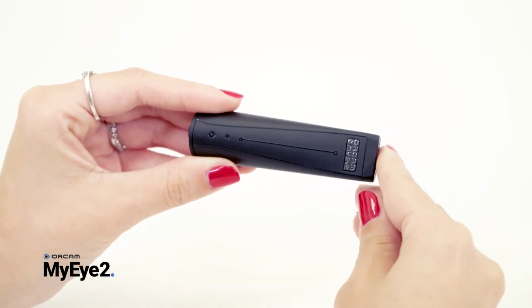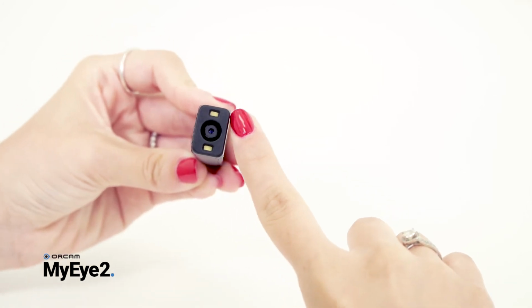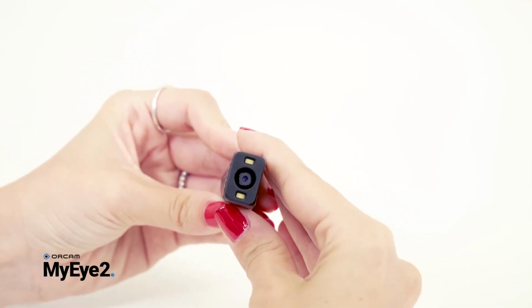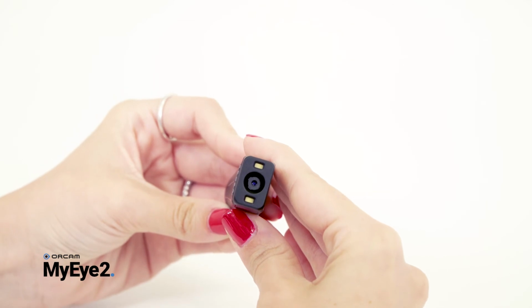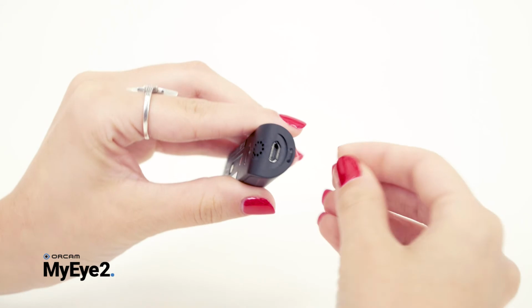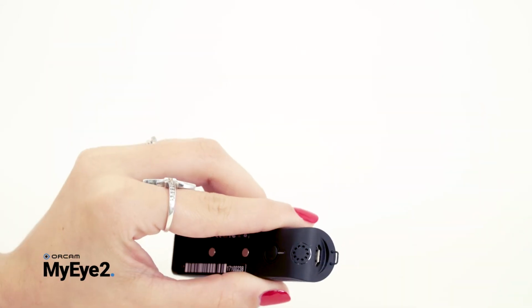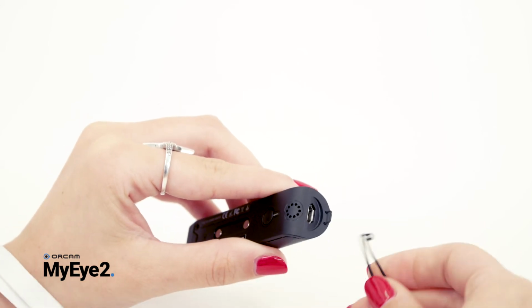When you reach the end of this side, you will have reached the camera and LED reading lights. It is best to avoid holding the device at this end so you don't obscure or smudge the camera. Before you begin using the OrCam device, you may wish to attach the provided lanyard to the eyelet loop at the back end of your device and wear it around your neck.